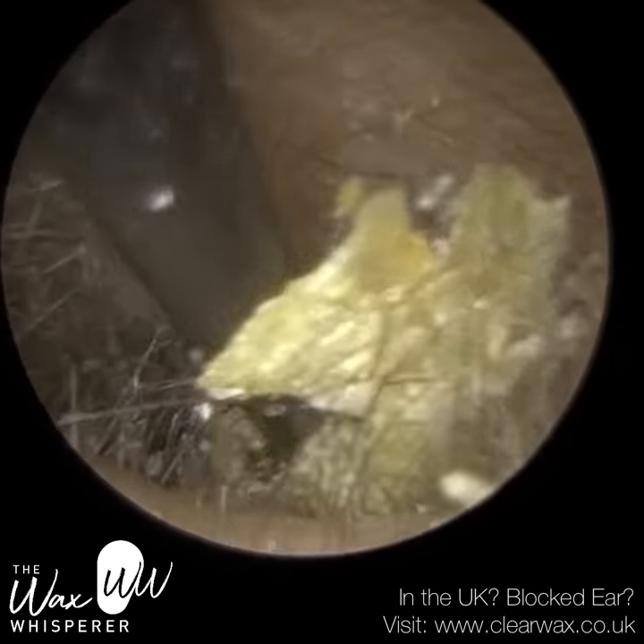There are quite a few hairs in there. Although I've removed quite a lot already, there's still a substantial amount of wax still in the ear. I'm using the elbow — the L bend, the 90 degree bend of the hook — just to glide it forward. You can see there's a big piece coming out, with all that dead skin enveloped around the circumference of the wax plug.